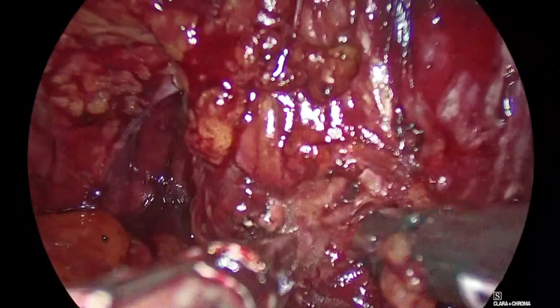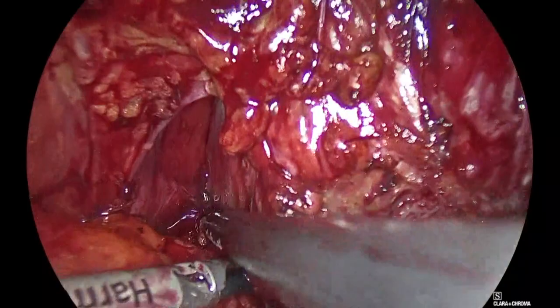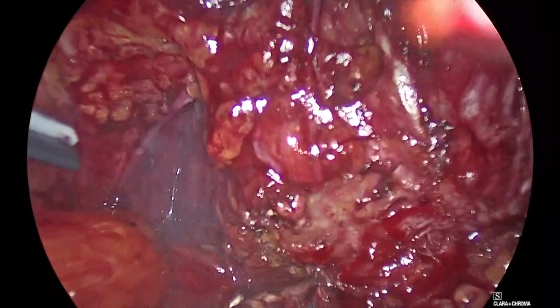So, left side here, we see the prostate margins here. You see this? Prostate margin are here. Good. Aspirate, Panagiotis, in there. And if I have doubts, I will show you again. I will fill the catheter again. If I have doubts of what I'm doing, once I get closer to the bladder neck, I will fill it up again. Go back, pull back.